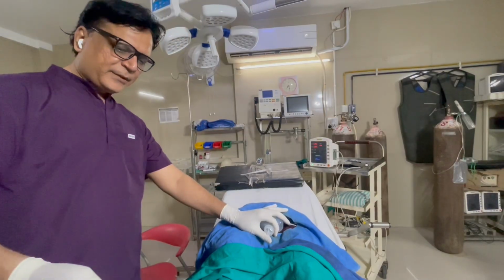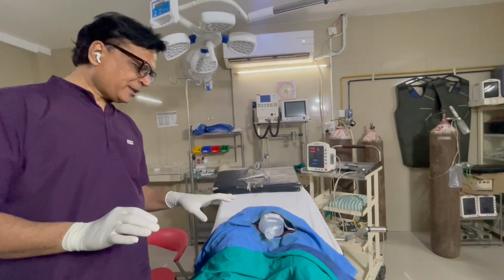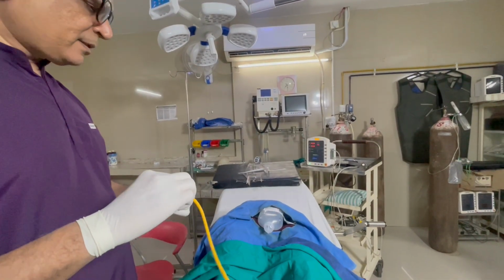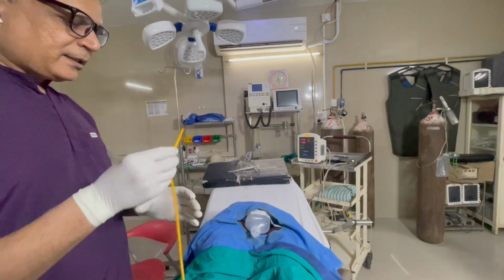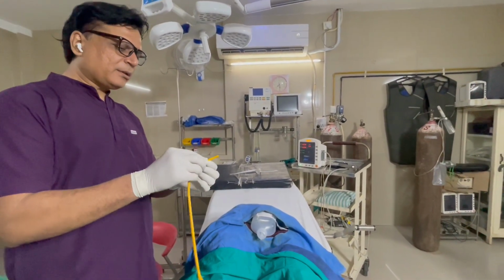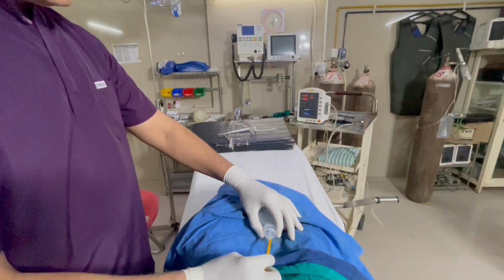So after putting it, I will be waiting for 3 to 4 minutes. So once it feels numb at this penile area, then I will open the catheter and hold behind the tip. Then with the other hand, I will introduce it.